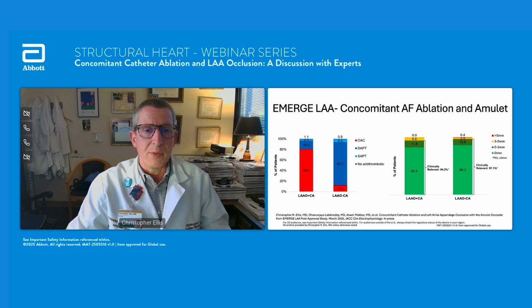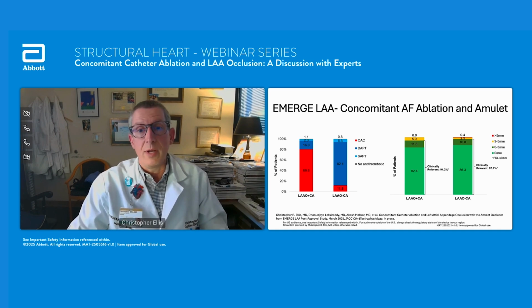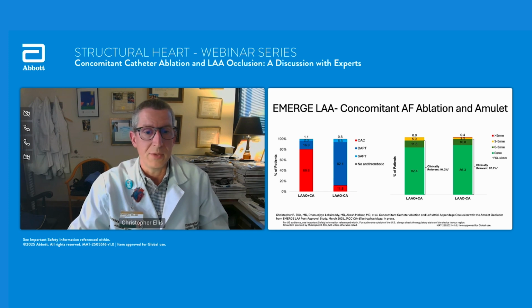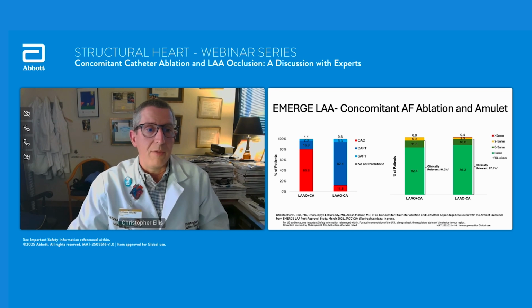The post-implant drug regimen, I think we'll get into a discussion and a Q&A on this. A reasonable number of patients, 80%, went home on systemic anticoagulation, because it's really what you would do after an extensive radiofrequency ablation. And so the good thing is that didn't show any kind of uptick in substantial delayed effusion or pericardial effusion or major bleeding rates in the patients that had the concomitant procedure. So, you know, that's the big flip. You can see the patients who have a standalone Amulet implanted, almost 90% of them are on either DAPT or single antiplatelet therapy, and only 11.8% went home on anticoagulant.